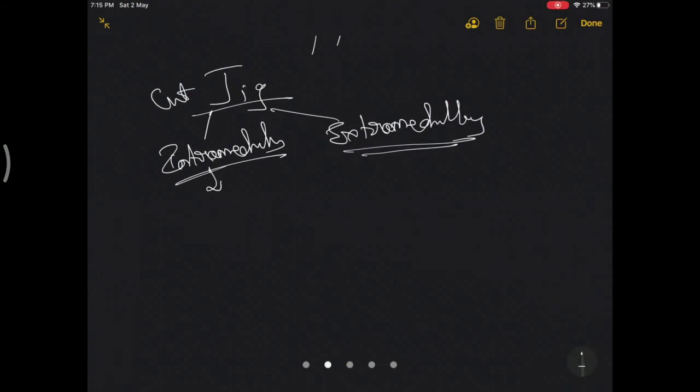They have a risk of fat embolism, and since it has to negotiate through the medullary cavity, if you have an extra-articular deformity, you cannot use this. These are the advantages of the extramedullary: the risk of fat embolism is less or nil, and you can use it in cases of extra-articular deformities.